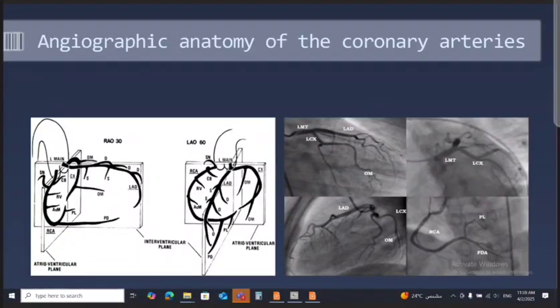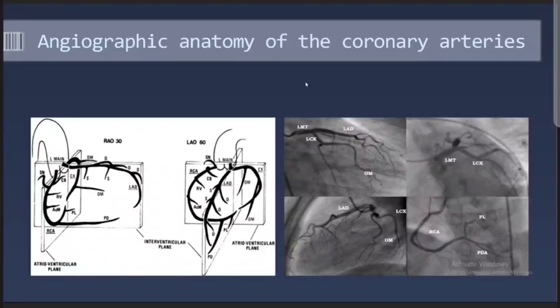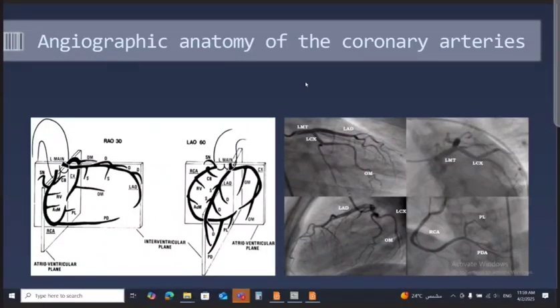The temporal resolution is also much better in catheter compared to the CT. If you remember, when we talk about the temporal resolution of CT, the best temporal resolution ever for the dual source CT was 75 milliseconds, while the temporal resolution for the angiography was... can anyone remember the number? 8 milliseconds. 8 milliseconds.